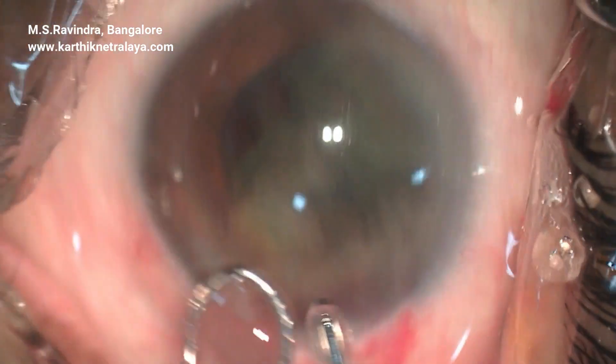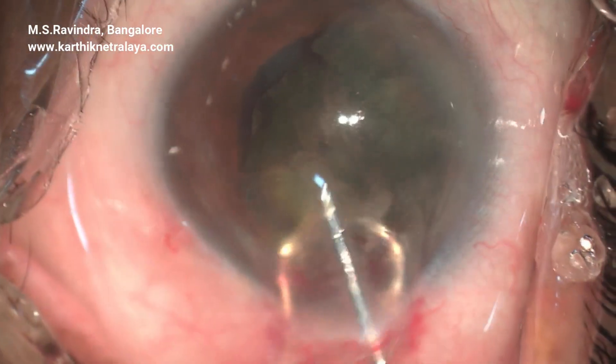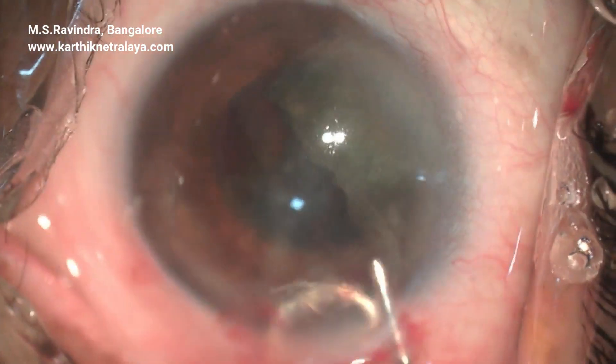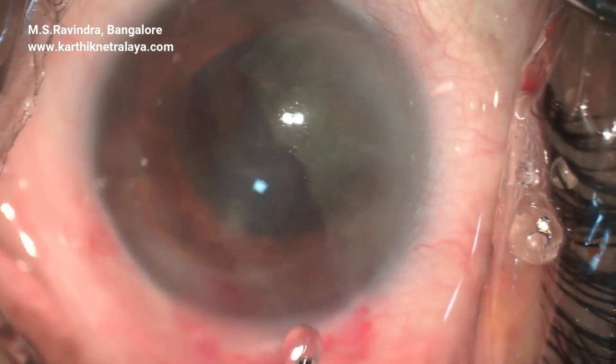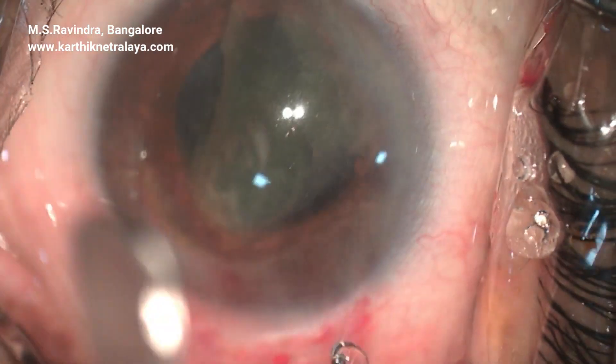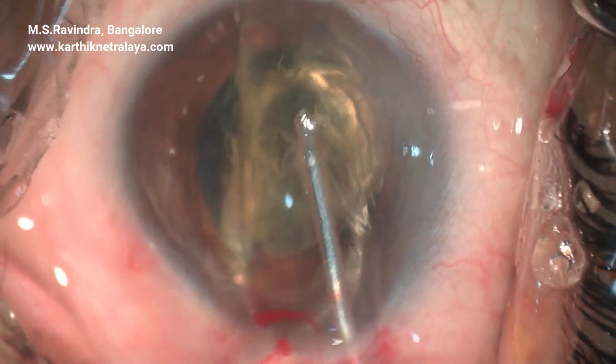The second half of the heminucleus is similarly expressed out of the anterior chamber. The cortex is systematically aspirated all around and an IOL is implanted inside the capsular bag. The patient has done extremely well post-operatively.